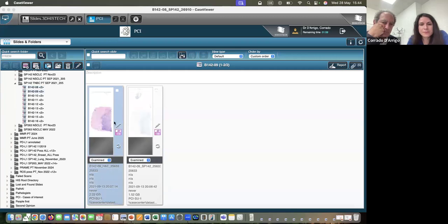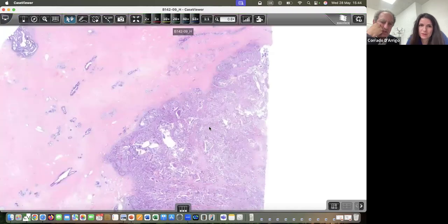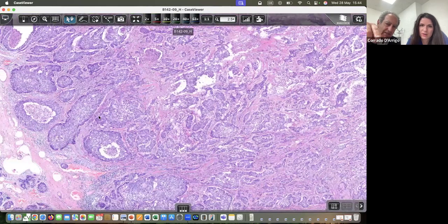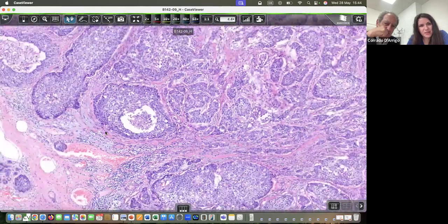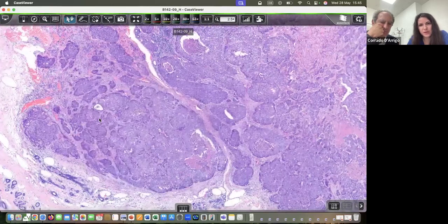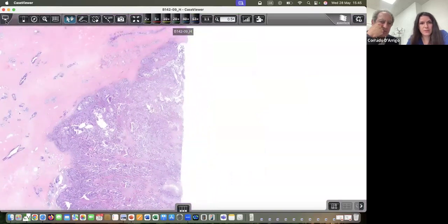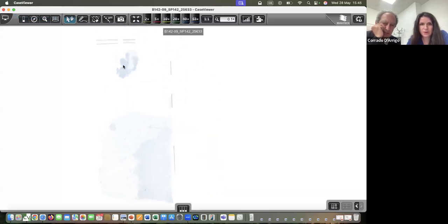Oh, that's a large slide. I hope we have some more exciting. Okay. Again, tumor tissue, you can see where it is. Just have a look on whether there is necrosis, because you need to stay away from it. And I think this is not DCIS. I think it's just tumor that has this pattern. So we need to be wary. So not really in situ. I don't think so. Just invasive everywhere. That's another thing we need to be wary of. Okay, PD-L1. The controls seem to have worked, right?